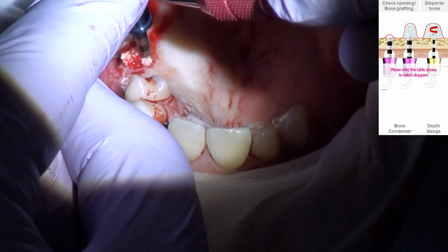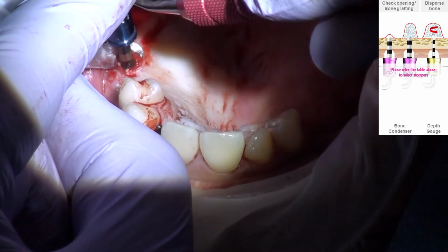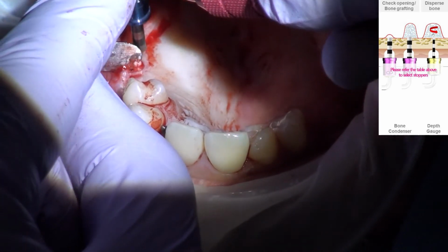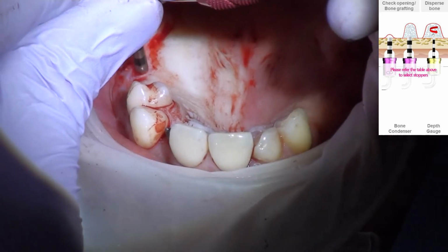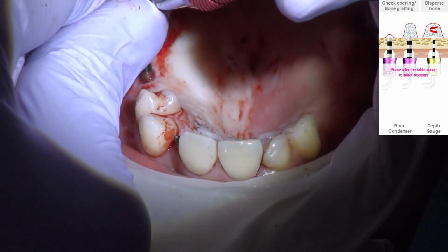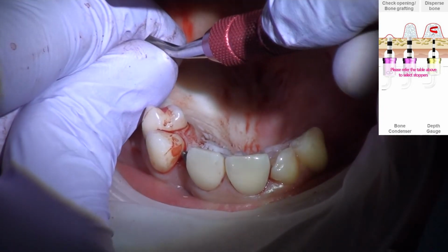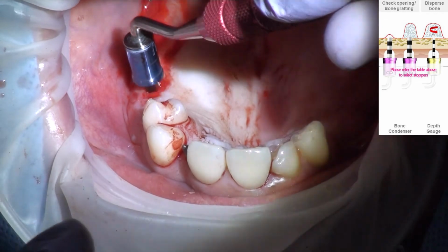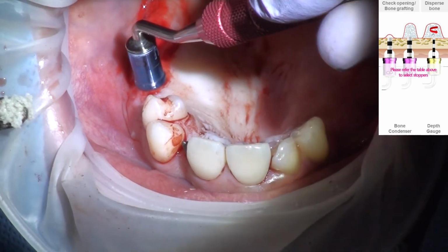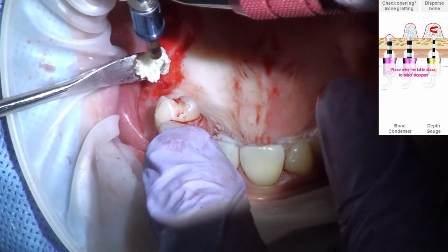I'm going to pack half of the bone that I just showed you on that dish. And then I'm going to take a PA. Okay. And that PA is going to tell me exactly how well my bone pack is. Starting to clog up a little, so I made sure I pushed it all the way to depth. We got that all the way to depth. If it starts to clog up, you need to get one push all the way to depth. It's just clogging up in the osteotomy.